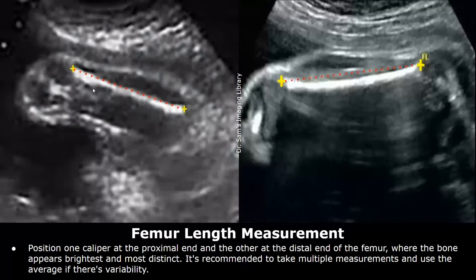Place one caliper at the proximal end of the femur and the other caliper at the distal end to measure the femur length. You can take multiple measurements and average them if you get different values.